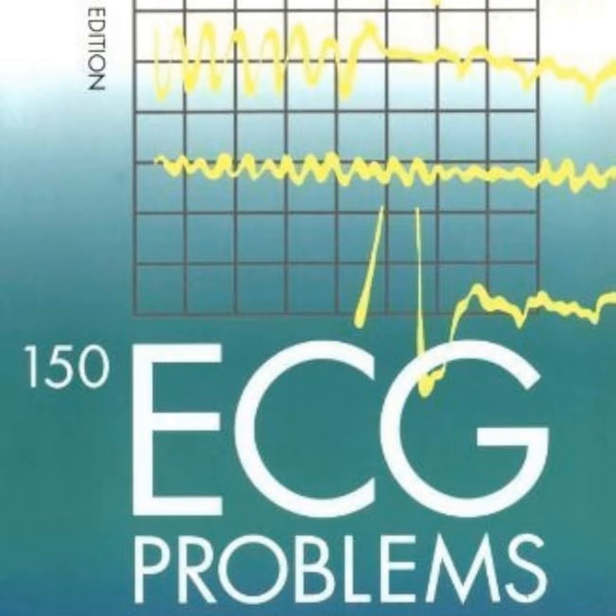Okay, let's contrast that chaotic emergency with a hemodynamically stable presentation. Say you have a patient presenting with palpitations. Heart rate is 180. The QRS is narrow, and P waves are either buried or retrograde. But they are sitting up, chatting with you, and their blood pressure is a solid 120/80. Okay, so this is likely an AV nodal reentry tachycardia, or AVNRT.